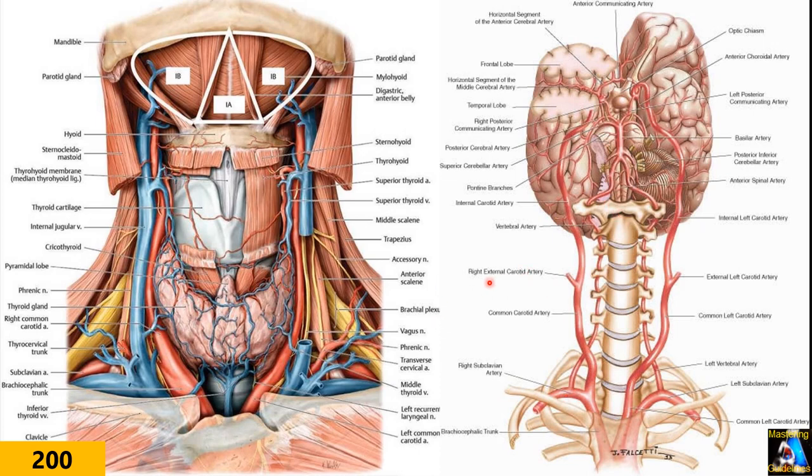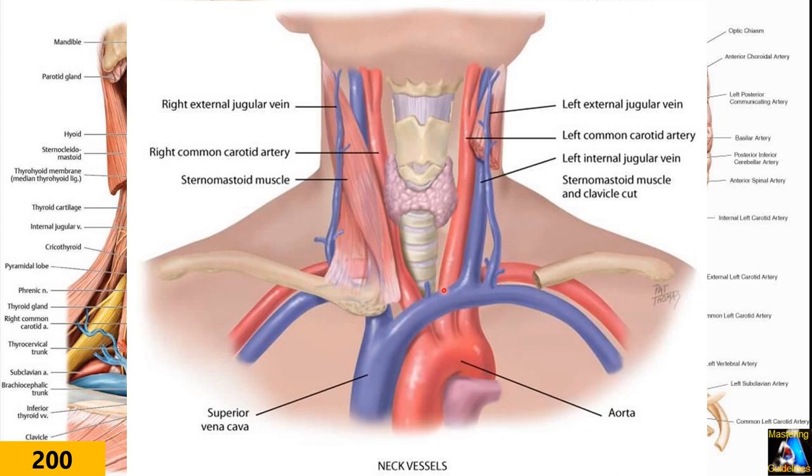Now for confirmation, look at this image. You have those vessels on both left and right sides. The right CCA origin is higher because it branches from the brachiocephalic near the clavicle — just a little fan down. The left you have to fan more deep. You can see the sternocleidomastoid, external jugular vein, and beyond the sternocleidomastoid those vessels. The internal jugular vein is anterolateral to the common carotid artery. At the level of the thyroid gland, when you pass the thyroid it becomes the distal CCA. A little higher becomes the bulb, and then branching starts at the level between the thyroid cartilage and the hyoid bone.